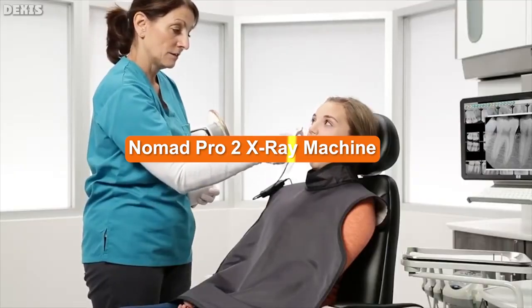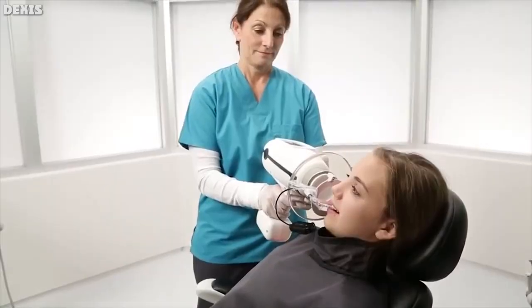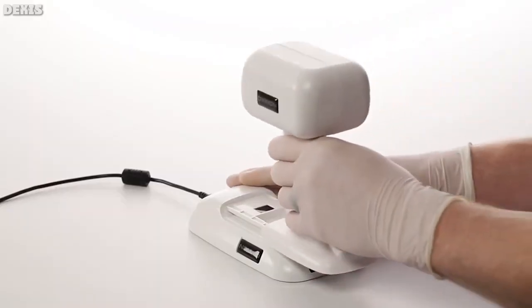With the Nomad Pro 2, you gain all the reliability and efficiency advantages that every busy dental office needs and appreciates. The Nomad Pro 2 provides a powerful freedom in workflow that is unattainable with wall mount units.